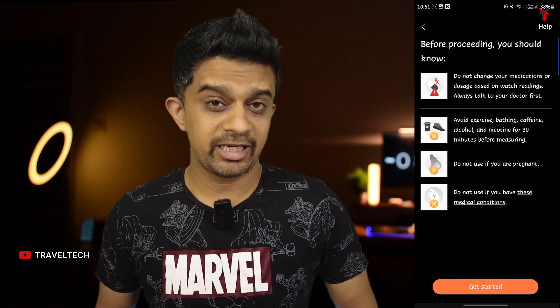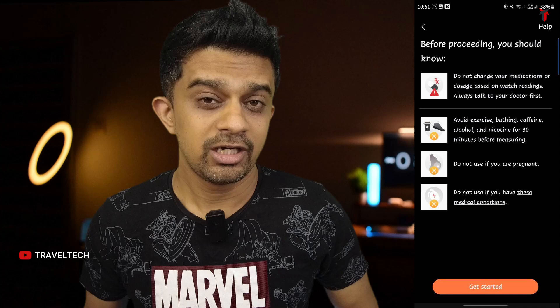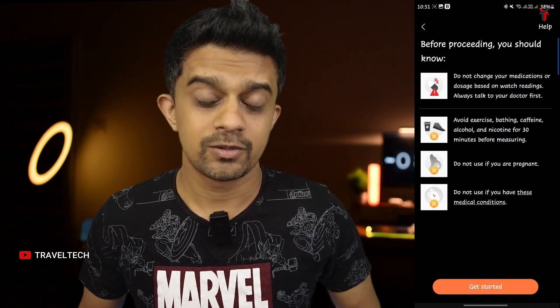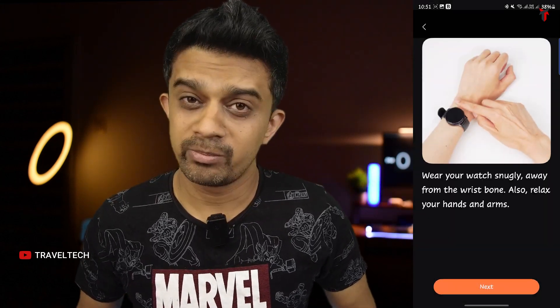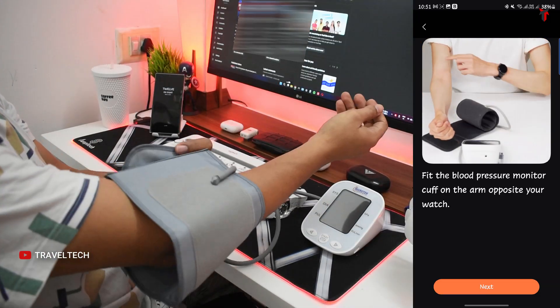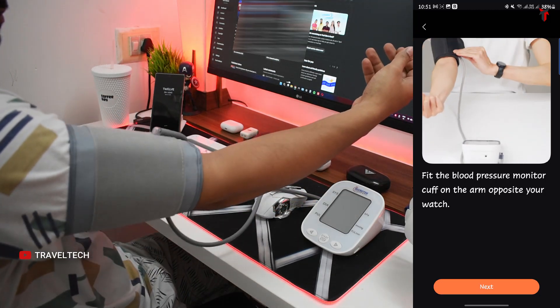Before calibrating, the app provides important instructions. You need to connect the smartwatch to the app, which gives you all the do's and don'ts. It also provides small mini clips showing how to wear the cuff. Importantly, you must wear your smartwatch snugly and wear the armband on the arm opposite to the smartwatch — if the smartwatch is on your left hand, wear the armband on your right, and vice versa.